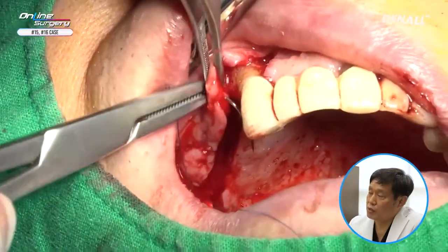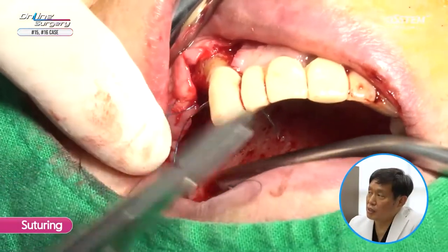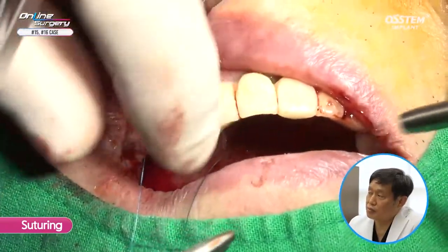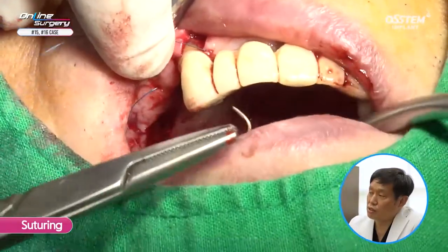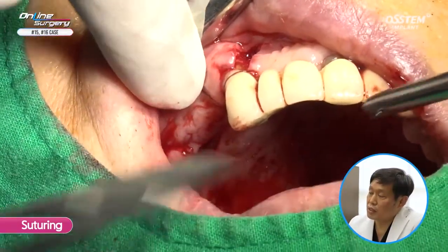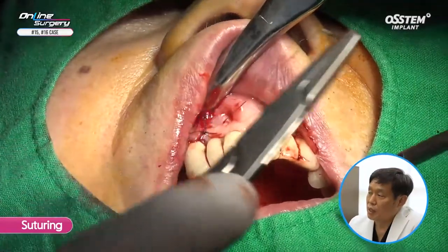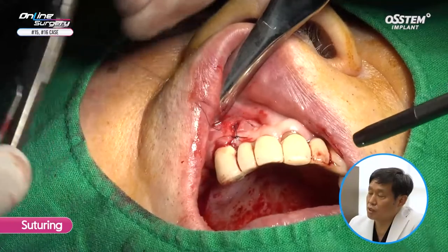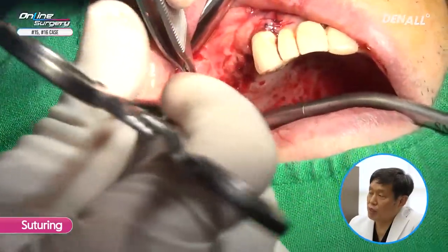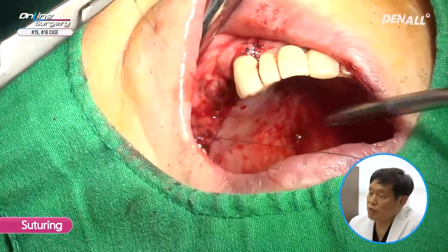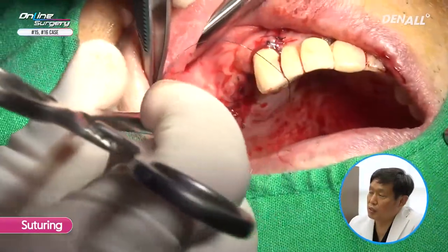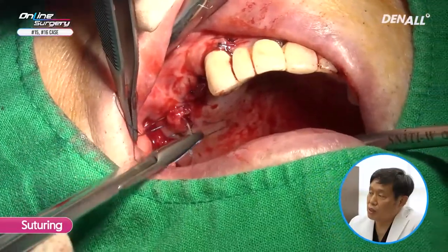Suturing is now going to be done on the distal side of number 13. The most critical area — I'm suturing here first. The canine area is used as an anchor to do proper approximation of the flap. I find the distal side of the canine most critical. On the front side where the vertical releasing incision was done, suturing is done. On the distal side, because I used a collagen membrane, when you do suture, you make sure you don't go through that collagen membrane. This is how it is being closed off.